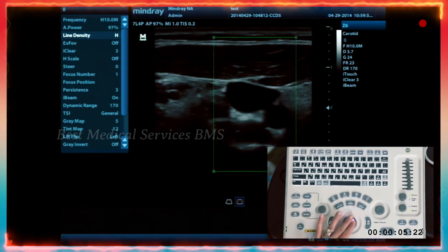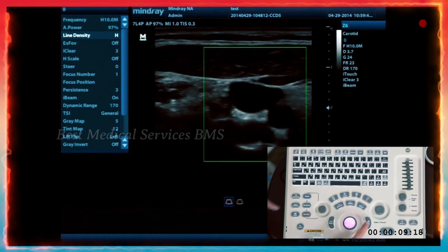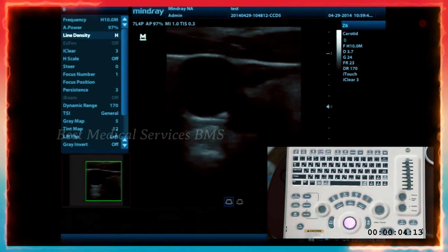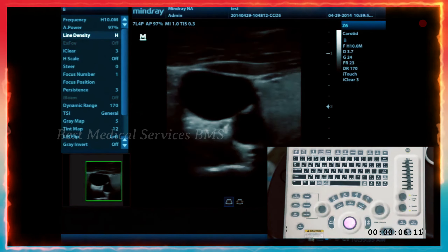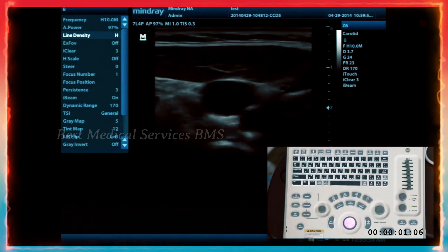Once you find the zoom area you want, hit the set key again. Then press the zoom knob to zoom in on that area. To disable the zoom, press the knob one more time — it'll take you back to depth and also unzoom your image.